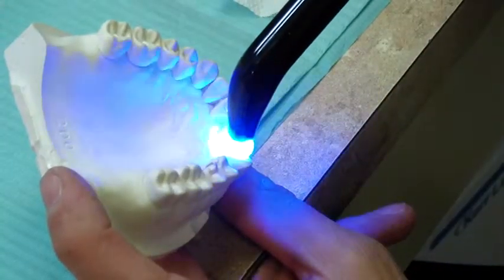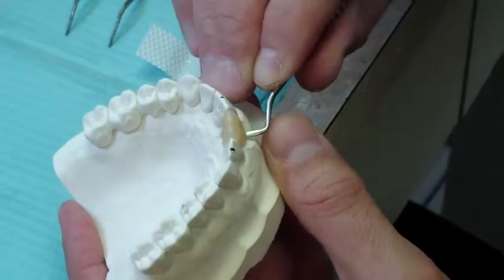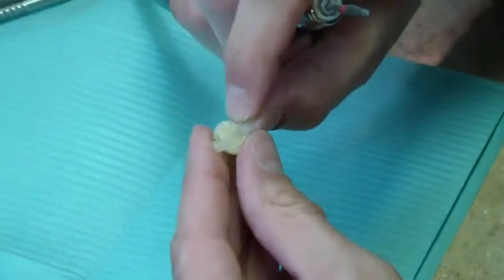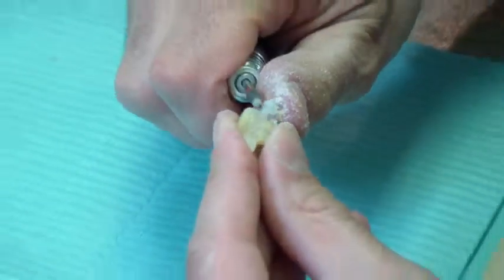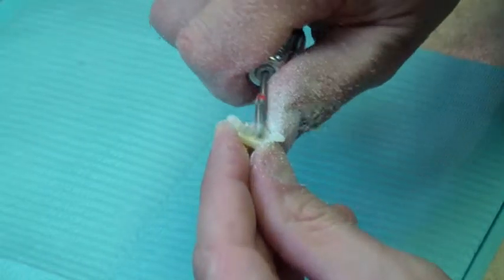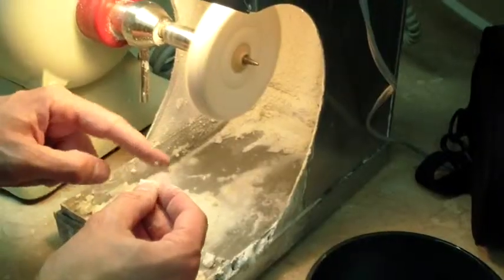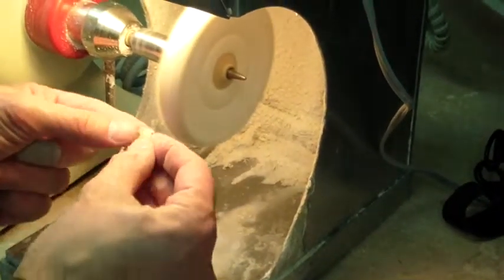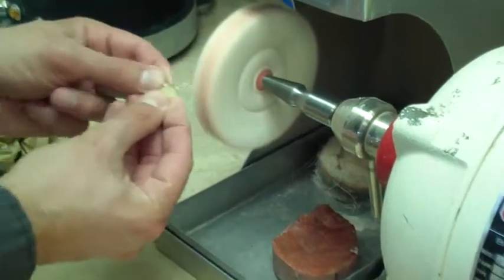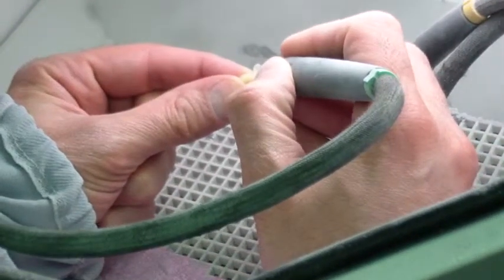Light cure the flow resin for 60 seconds. After curing is completed, remove the space maintainer from the model and trim the excess resin using your preferred trimming burrs. Using pumice, carefully clean the space maintainer to remove any rough surfaces. Polish using a felt wheel. The wings of the space maintainer are now sandblasted on the lingual facing surface to enhance bonding to the tooth structures.